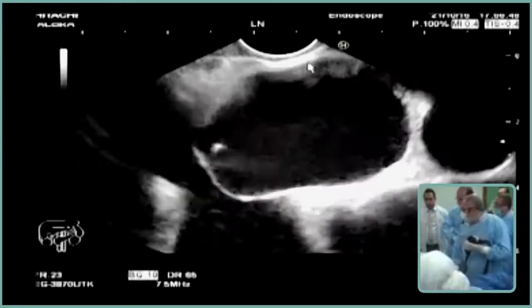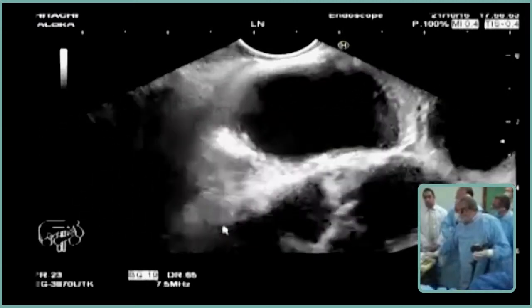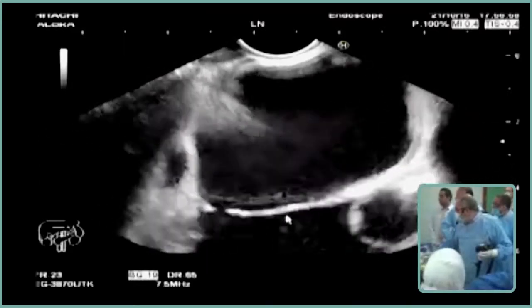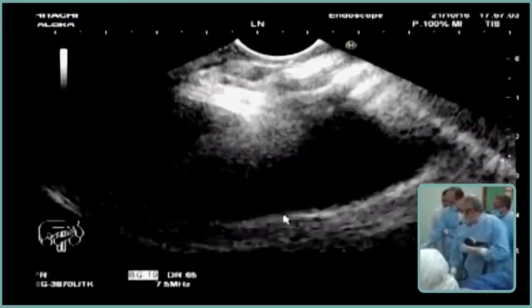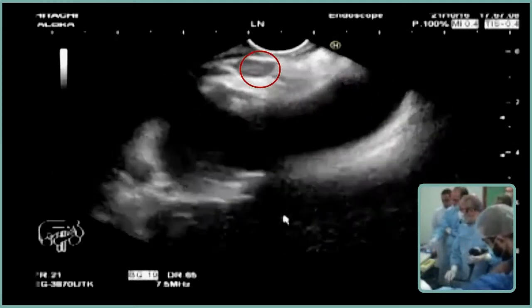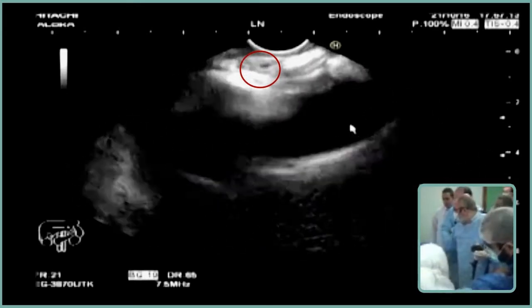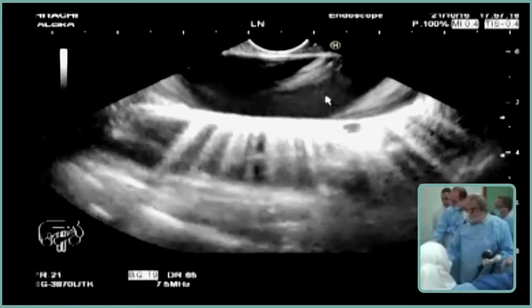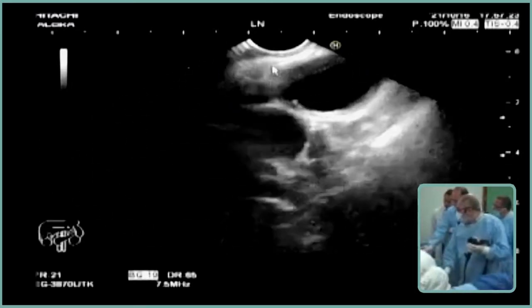When I keep withdrawing, this is the left atrium. This is the left ventricle, and this is the valve between the left atrium and left ventricle — the mitral valve. Coming to the subcarinal: this is the subcarinal area. There is a lymph node, but it is not large — it is small in the subcarinal area, in between the left atrium and the right pulmonary artery. This is the aorta, then this is station 8, then station 7 — subcarinal.